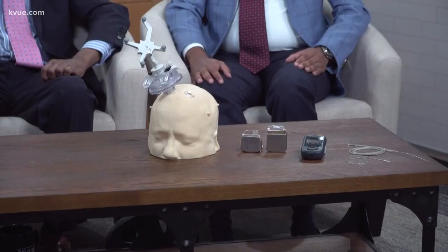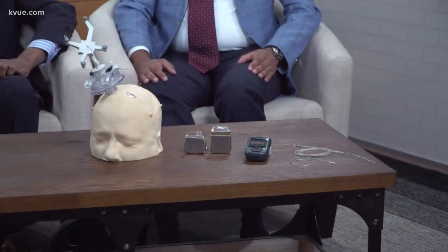Morning. So first and foremost, tell us about, in layman's terms, this process that you do. So Parkinson's disease is a disease that affects the ability for patients to move smoothly. They end up moving very slowly and are very stiff, often have a tremor, and it's due to an abnormal circuitry in the brain. Basically what we do is we install a pacemaker for the brain that kind of affects that circuitry and makes their movement more smooth and helps with their tremors.